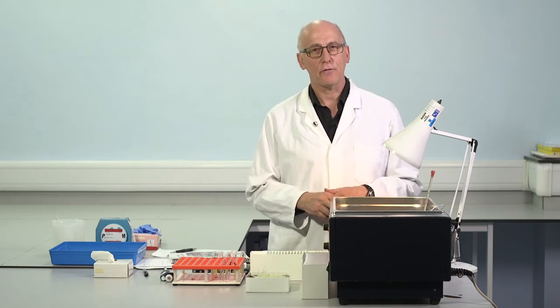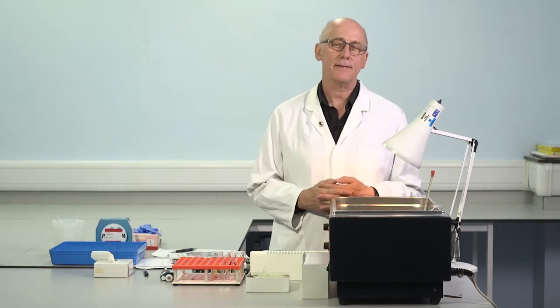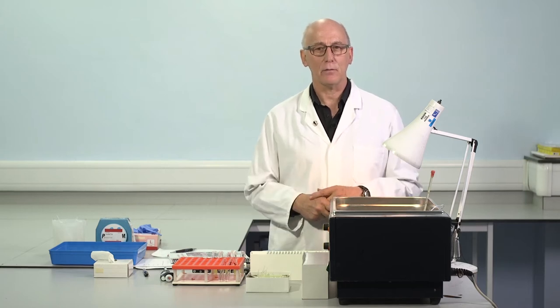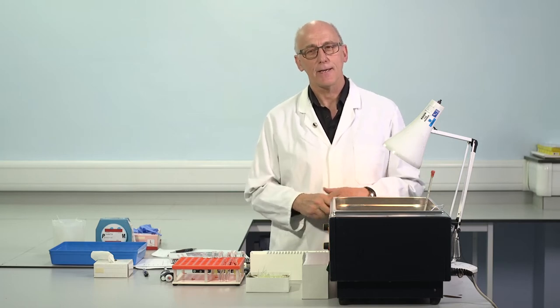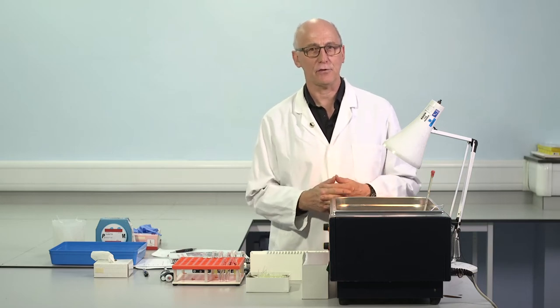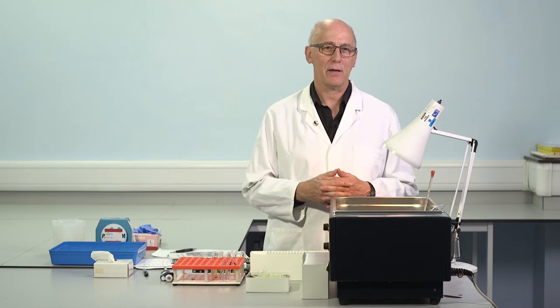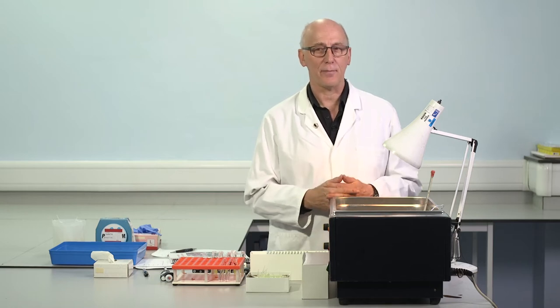Actually, I think it's essential for all hemostasis laboratories to have available a water bath like this. It's particularly useful to control the thawing conditions for frozen samples. Many of us will perform tests on frozen patient samples from time to time. I imagine many of you will do the same. And I think it's important then to follow careful thawing conditions. We should thaw plasmas for 3 to 5 minutes in the water bath. They should not thaw at room temperature, otherwise we risk cryoprecipitation and loss of some of the important proteins. So I think we all need a water bath.